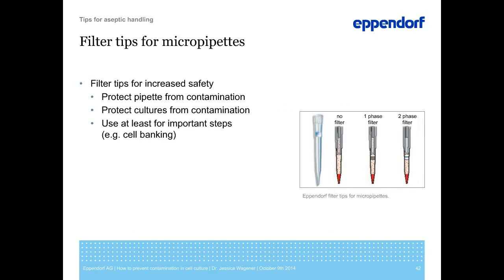Using filter tips protects the cells from being contaminated, and it protects the pipette from being contaminated. So you might consider using filter tips at least for the very important steps like freezing of cells to build up stock cultures.